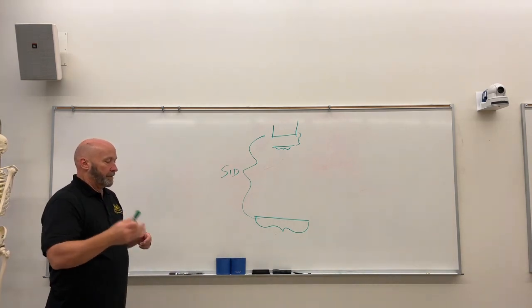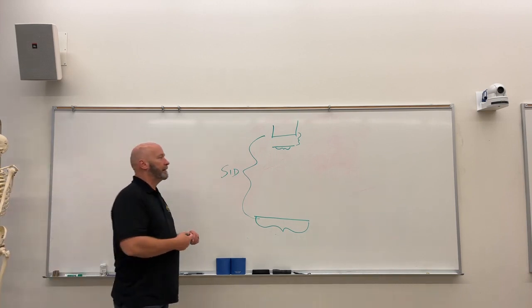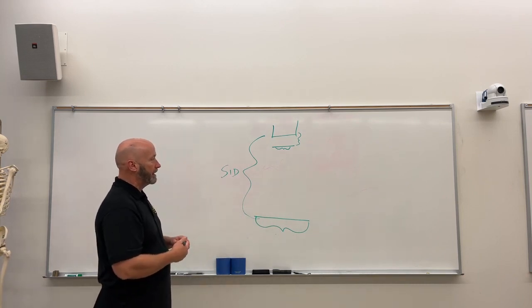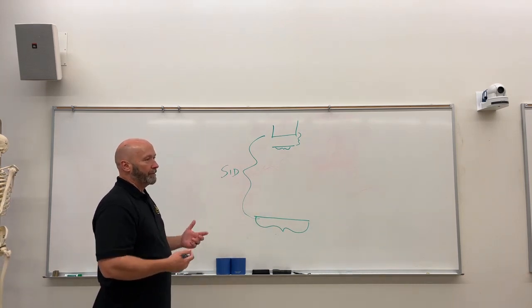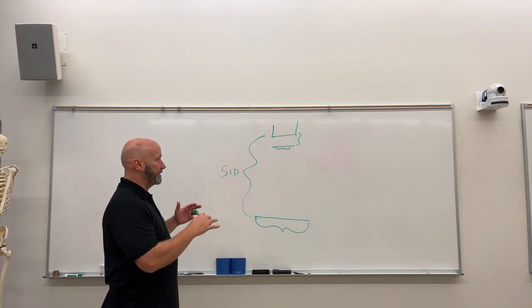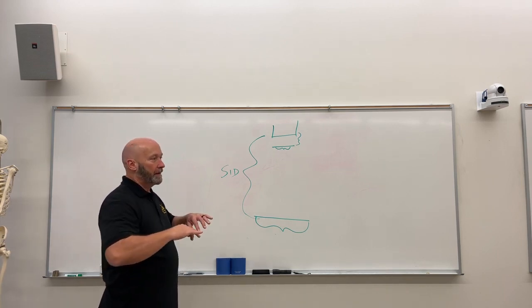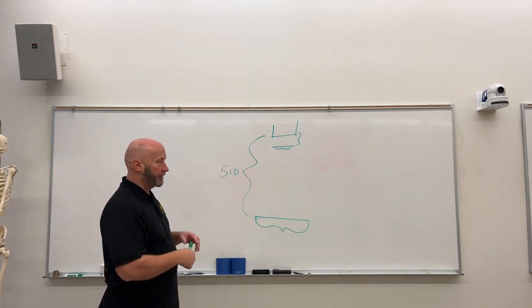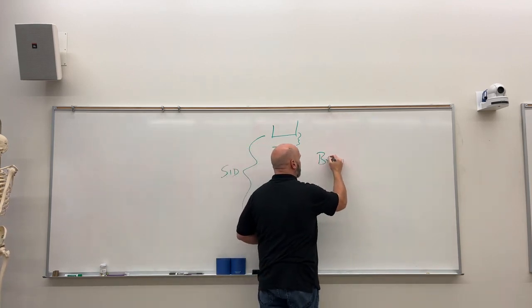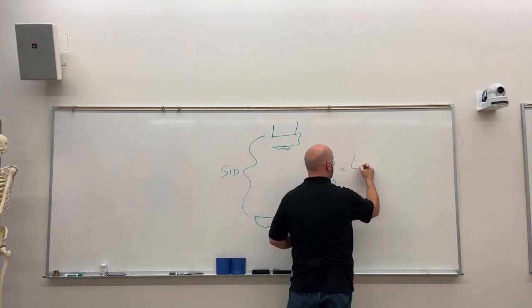And you can look in the Bushong on 298, I think it was, 298, yeah. And you can look in the Bushong and see what represents what in that. But the easier way to remember it, this is a ratio type problem. And so it doesn't really matter how you set it up as long as you're comparing the right things. And that's the vital thing. All right, so the way I recommend that you work this is big over big equals little over little.